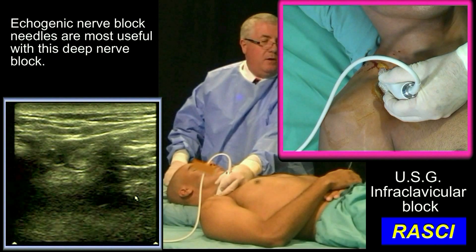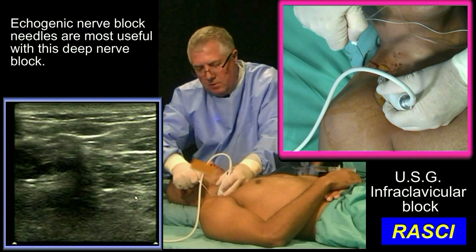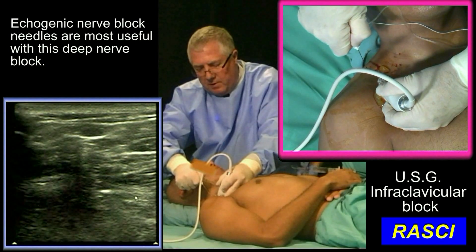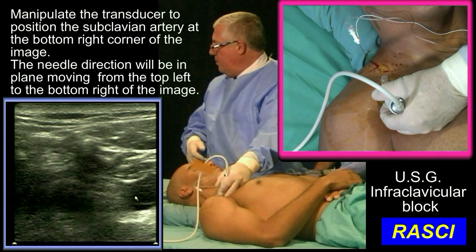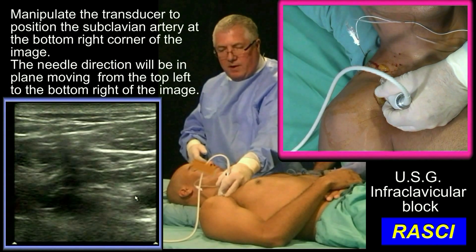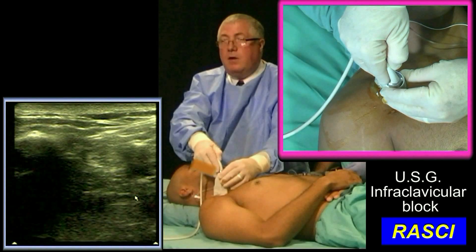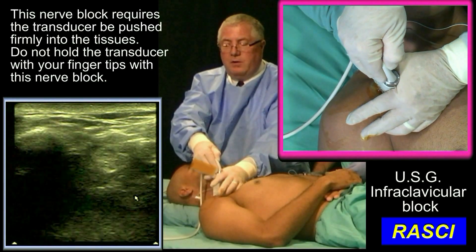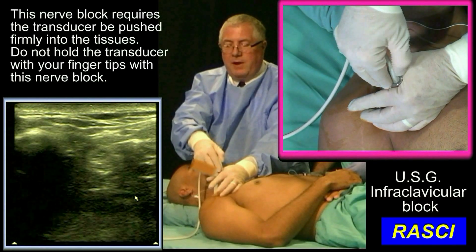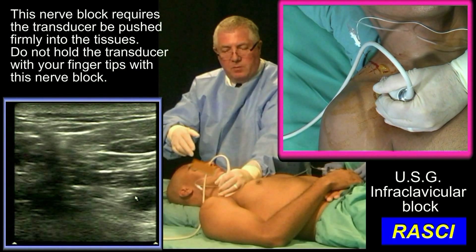I'm going to use an echogenic needle here. It's quite a blunt needle, so it's quite tough to get through flesh. Now I'm going to establish the image that I want. I always want the artery touching the edge of screen. Sometimes I have to lean the transducer looking slightly medial. Holding the transducer at the base of my thumb gives me a little bit more endurance.